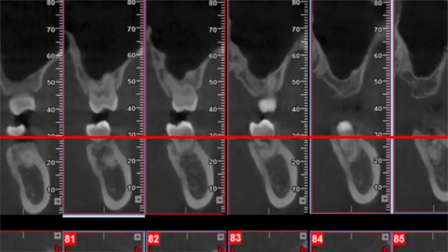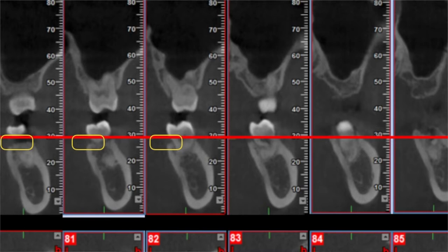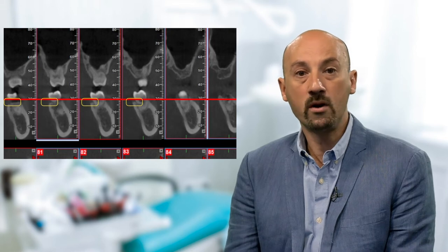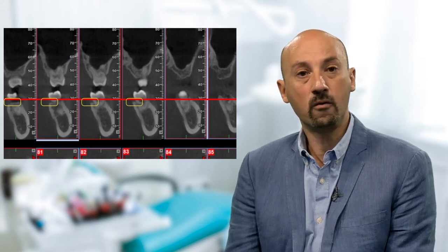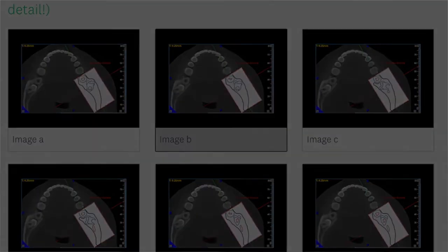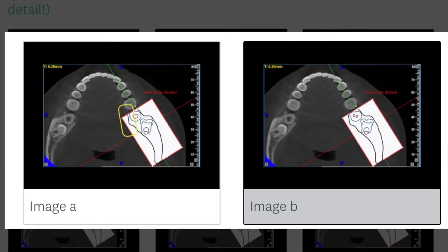Looking at the vertical slices, if we start from the most mesial slice marked with number 70, we can see, for example, that the bone is much lower than the red line. This means there is absolutely no bone at the lingual side of the second molar at the level of the red line for at least the first three slices. Consequently, in the horizontal slice we want to reproduce, there will be no bone lingual of the second molar for the first 8 mm. This finding alone should be enough to reject slices A and B, because in these drawings there appears thick bone lingual of the second molar.